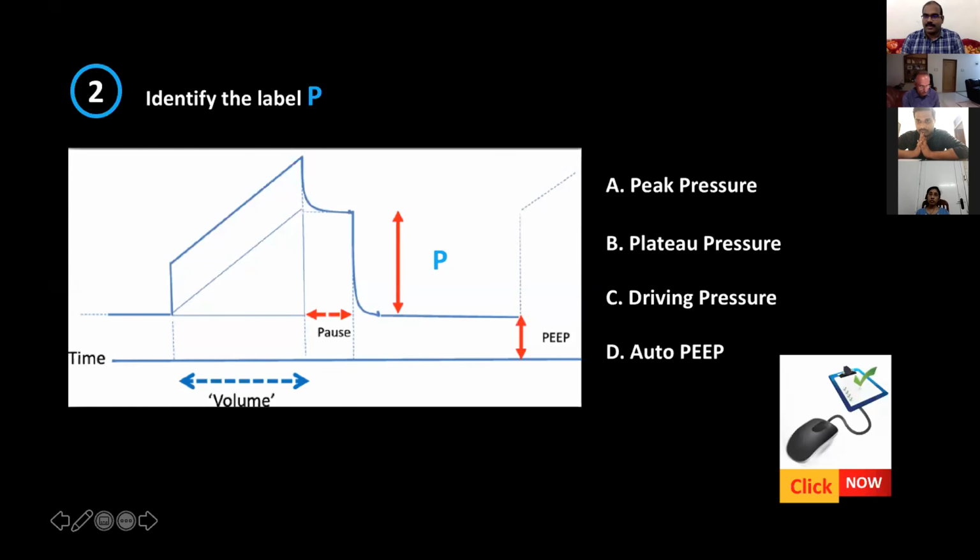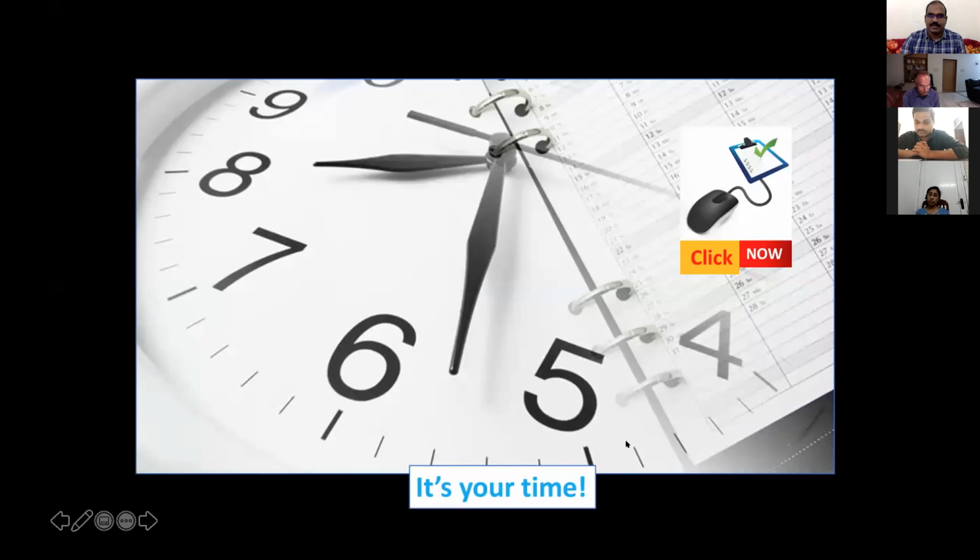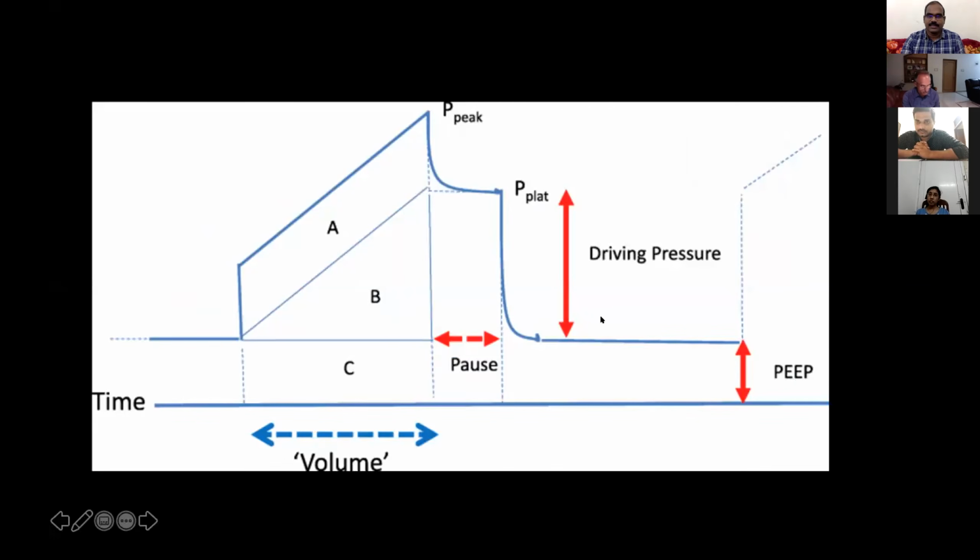Dr. Tinson nicely connected it to the static compliance also. We'll discuss that further in lung protective ventilation. This is the graphic, the pressure versus time. It reaches a pressure peak, or peak inspiratory pressure, because different ventilators have different terminologies, P peak or PIP.